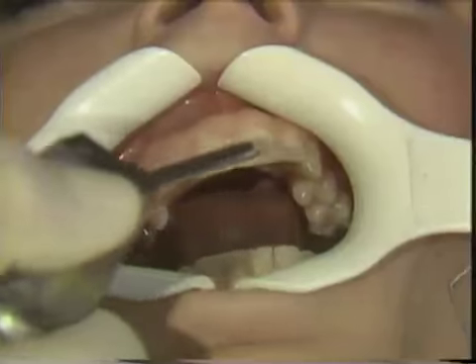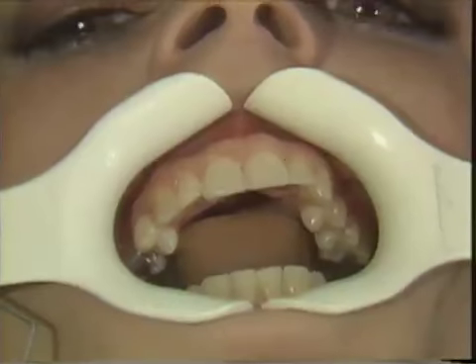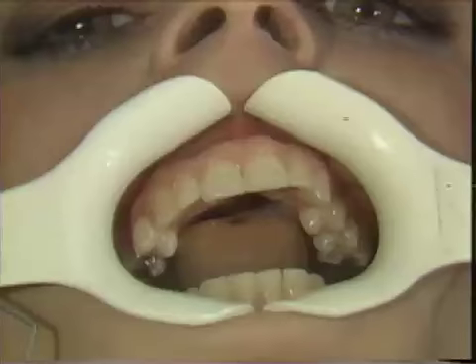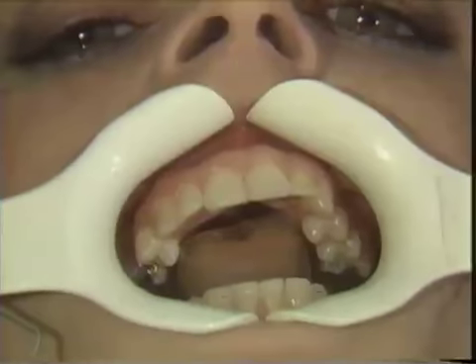You want to talk about the etch and the various chemicals that you use for that? The etching material that's being used currently is a 37% concentration of phosphoric acid. It's available in two forms, either a liquid or a gel. And it does not matter which form you use, the effectiveness of the etch is the same.